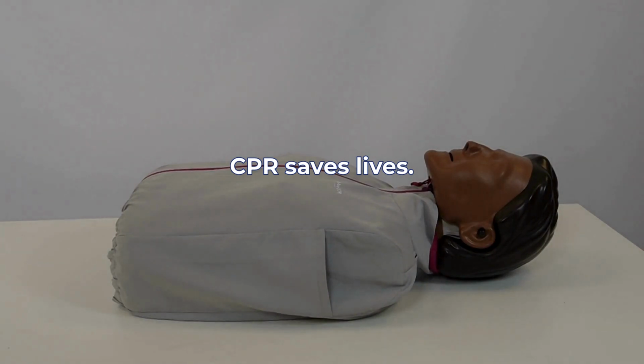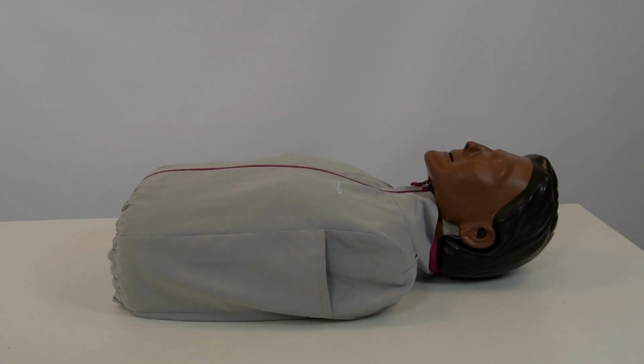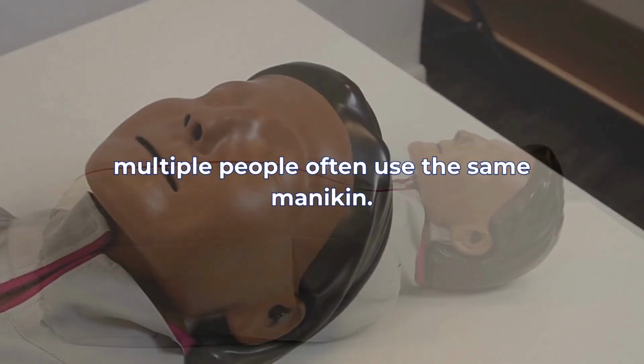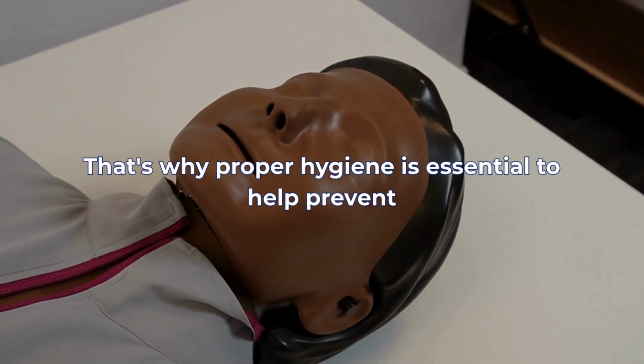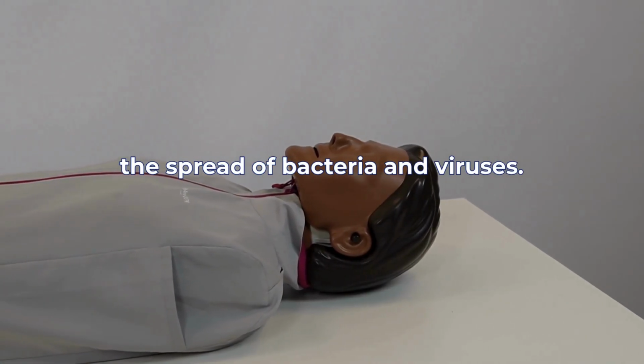CPR saves lives. But safe training starts with clean CPR mannequins. During CPR training, multiple people often use the same mannequin. That's why proper hygiene is essential to help prevent the spread of bacteria and viruses.